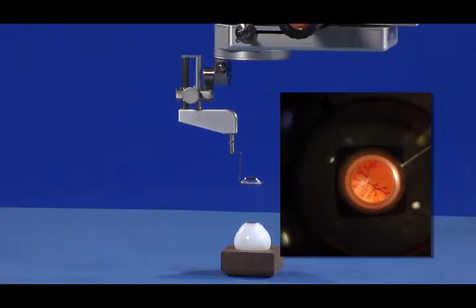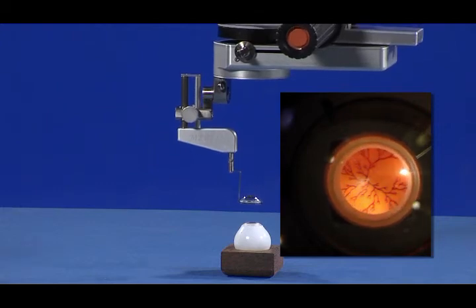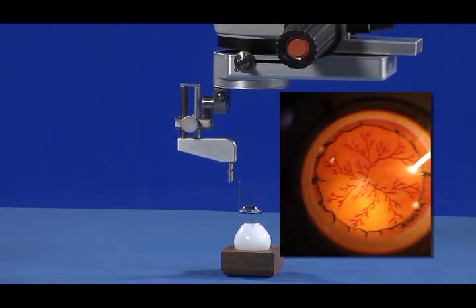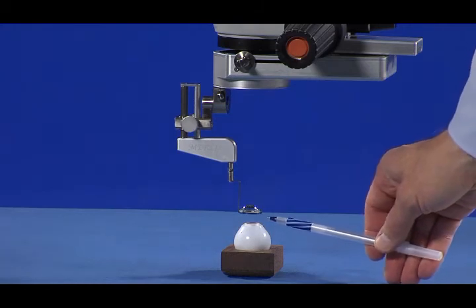The fifth and final step is to use the microscope focusing pedal to move the microscope downward closer to the eye. As the Merlin Surgical Lens moves closer to the eye, the field of view of the retina will increase. A suggested position for the Merlin Surgical Lens relative to the eye is about 5 mm above the cornea.